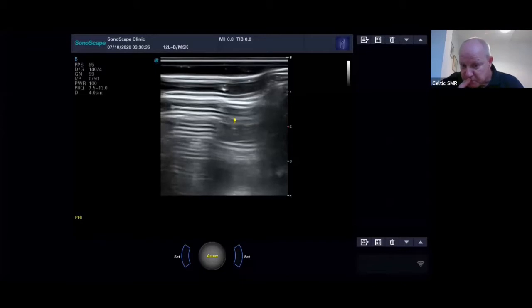No, I don't know a way that you can do that, because the radial tuberosity is here, so I don't know how you're going to get to it. You need to come medially to see its attachment. You won't see it from this side. The cobra view, you can see just that distal bit the way I showed you. The best way to see it is either tracing it down and then angling in, or angling from the medial side across, because the tuberosity is around here somewhere in the middle. So no, I don't think you can scan it laterally. Just a suggestion, lateral to medial.